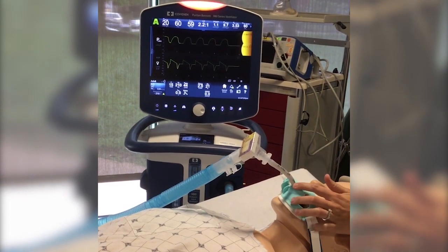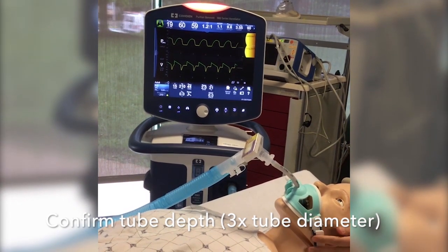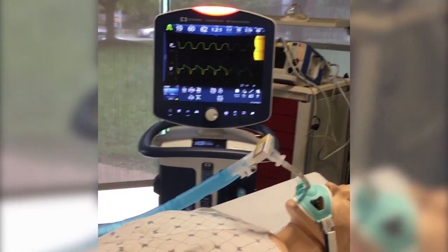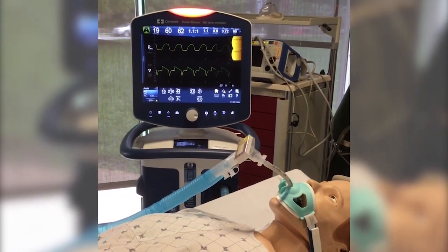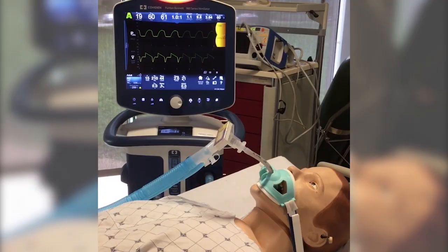Second, check your tube depth and secure the tube. Remember, the depth should be about 3 times the tube size, about 22 centimeters for a 7.0 tube. Then, place an OG tube and set it to low intermittent suction. Now, you can elevate the head of bed to 30 degrees to help minimize the aspiration risk.